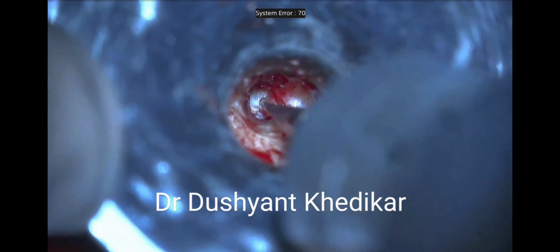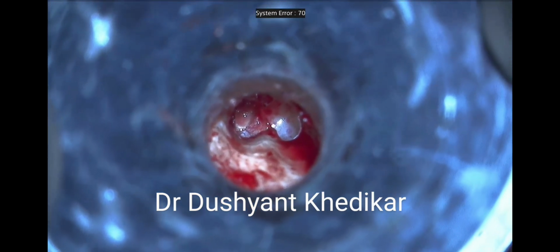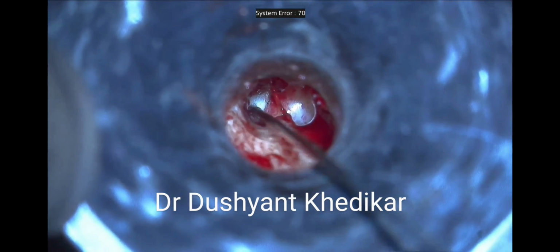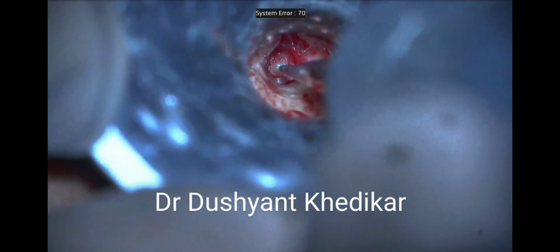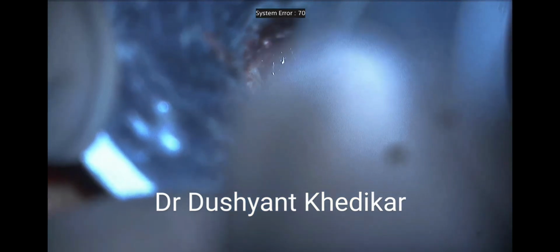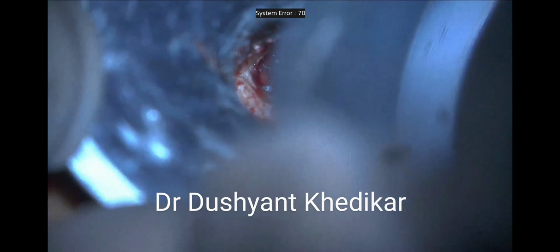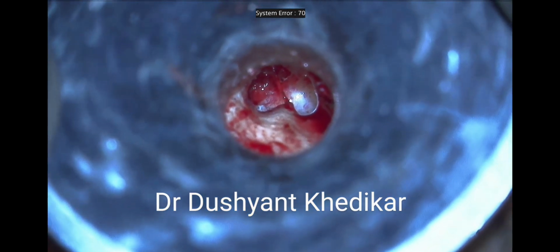As the saucerization of the footplate is continued, you will appreciate the change of color of the footplate from a dense white color to a light blue color. This is called as blue thinning of the footplate. Here you can now appreciate the appearance of bluish hue over the footplate. Saucerization is further carried out to make the footplate saucerization as uniform as possible.